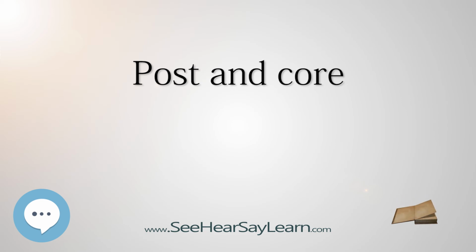Prefabricated post and cores take less time to place, as they do not involve any lab work and can be inserted immediately upon the decision to utilize them, once the endodontic therapy has been completed and the post space cleared of gutta percha. After the prefabricated post is properly cemented into the post space, a core material, such as dental composite, can be packed around the cemented post.